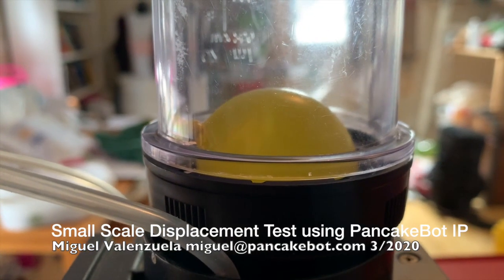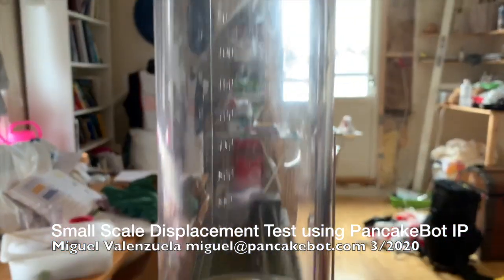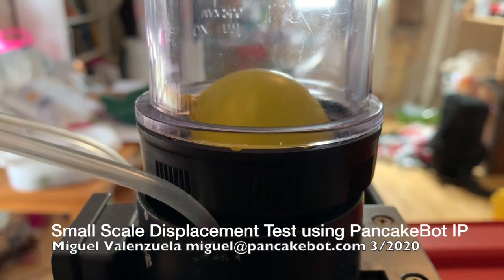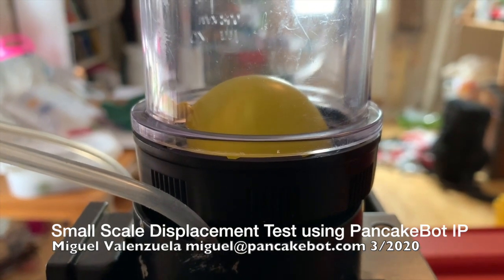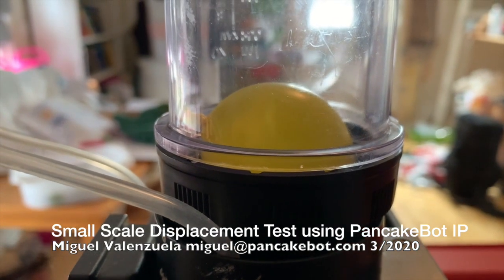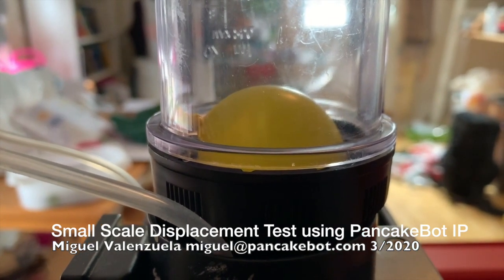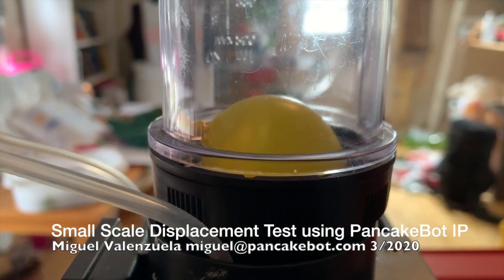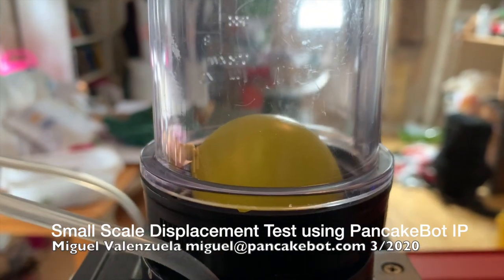This is a pancake bot and this is the pancake bottle. Right now there's a continuous air pump inside of it, switching between positive and negative pressure, and you can see that the balloon is expanding and contracting. This can be used with a bag valve mask that is used for respirators.